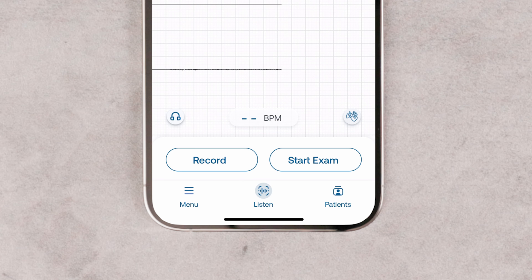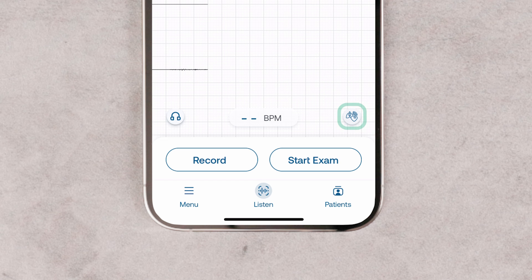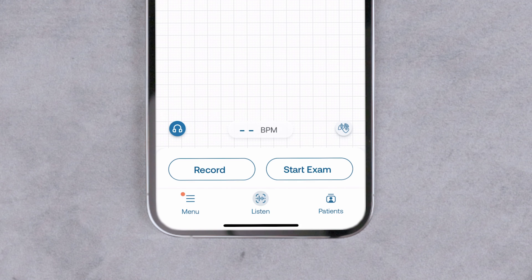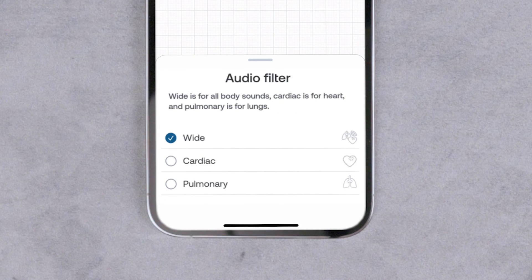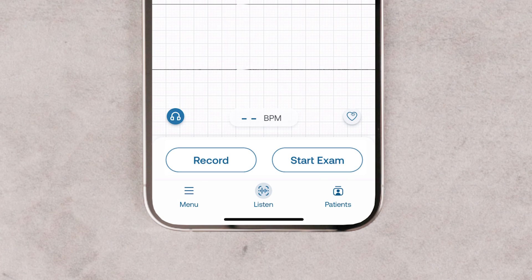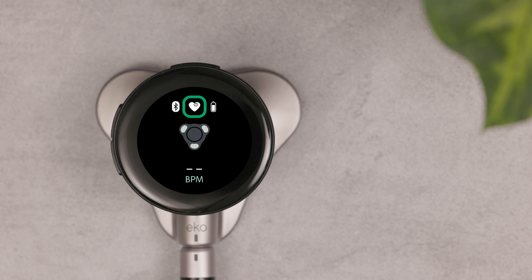When the Core 500 is connected to the Echo App, you can see the current filter on the bottom right. To change the filter from the app, tap the audio filter icon. Tap the filter you want to change to. The filter is changed on both the app and the Core 500.